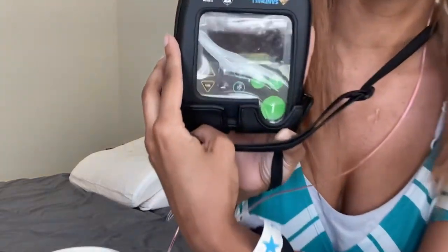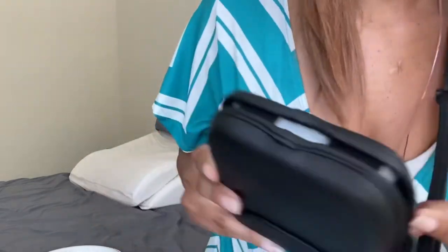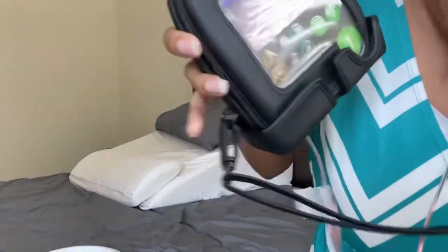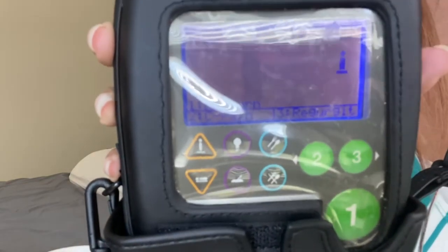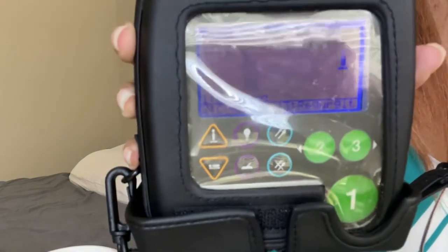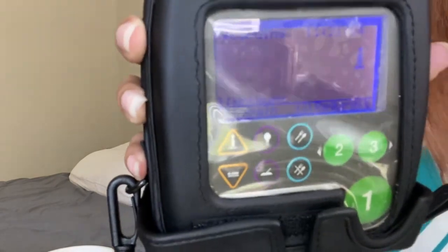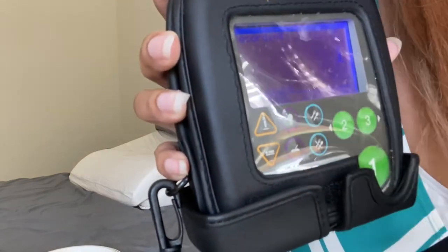With this machine, when you hold it up to yourself, everything is right side up for you to look at. On my machine, hopefully it's in focus, some of the things it's going to show: you have a light button that turns the light on.